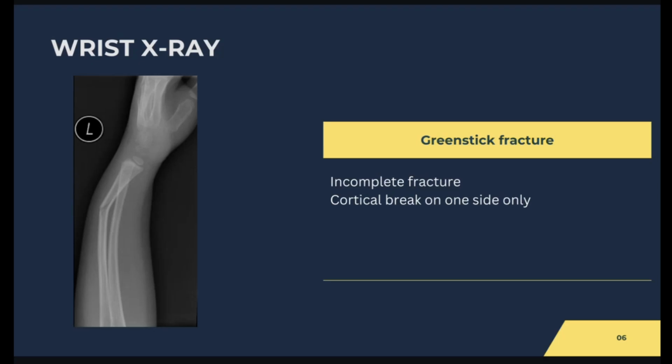About the scaphoid, you're more worried about the mid shaft due to the way the patient has fallen, I believe, in this scenario. But it is important if you can't find any abnormalities on an X-ray that you can redo a scan a few weeks later. But I'm not sure how this works in pediatrics, but Dr. Ajalogba can help us out.